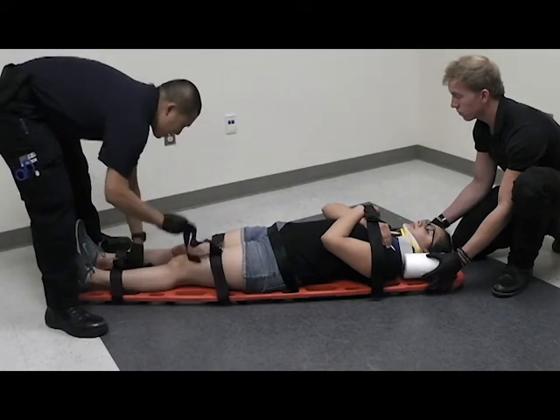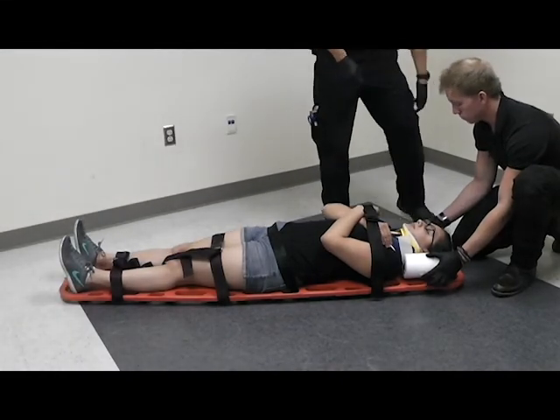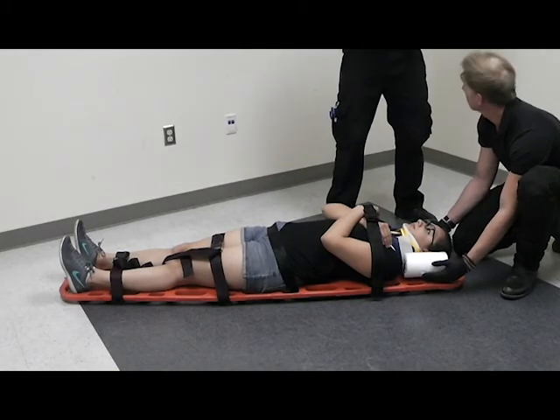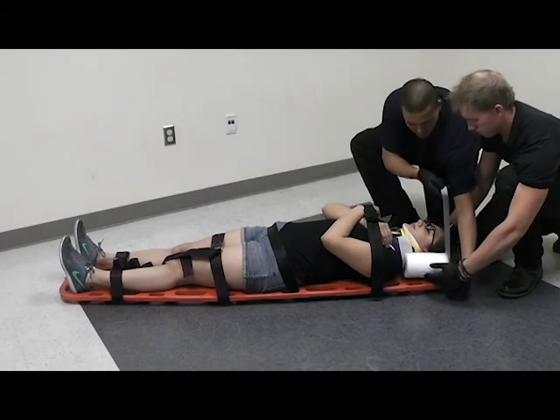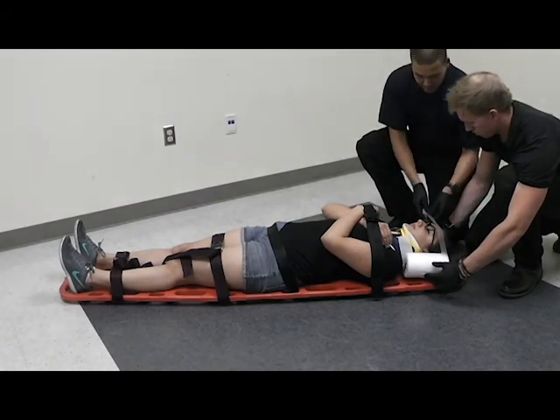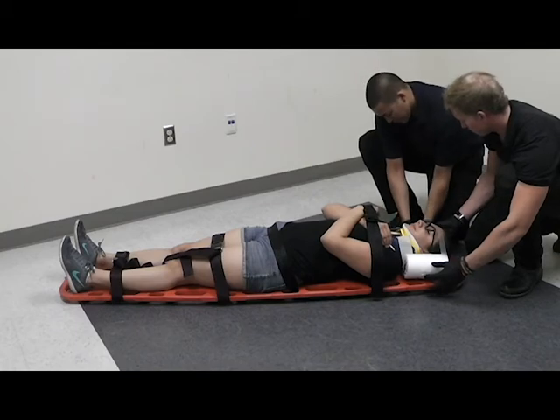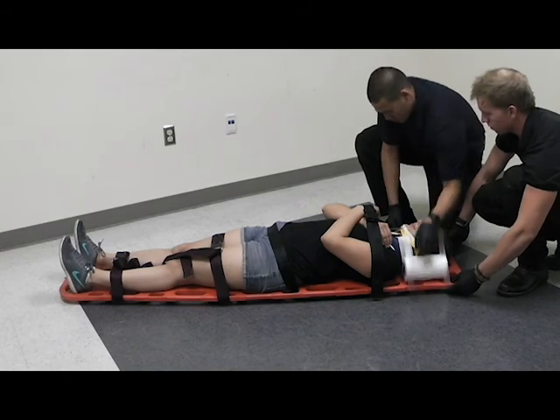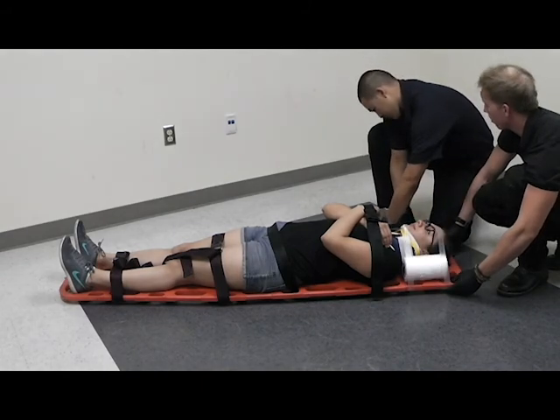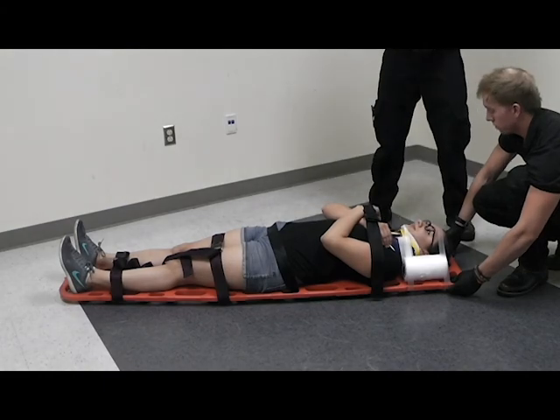I'm going to get the straps out of the way, then secure the head — securing the strap going over the forehead and over the chin area, securing the headblock. And then over the chin area — and that is long spine board immobilization.